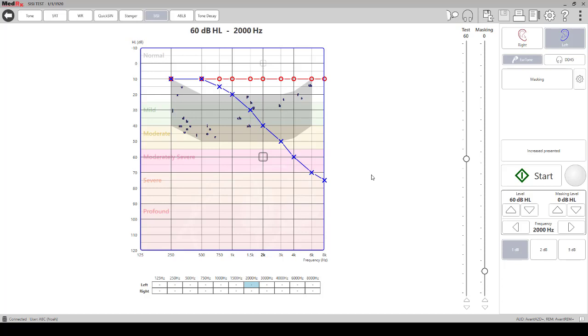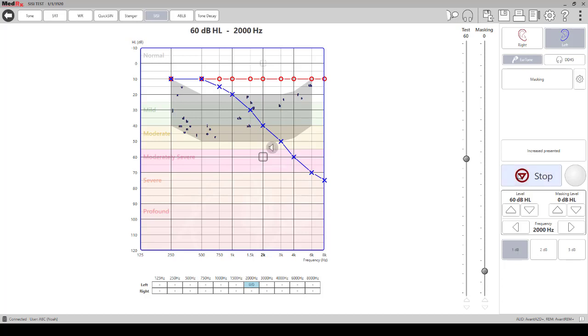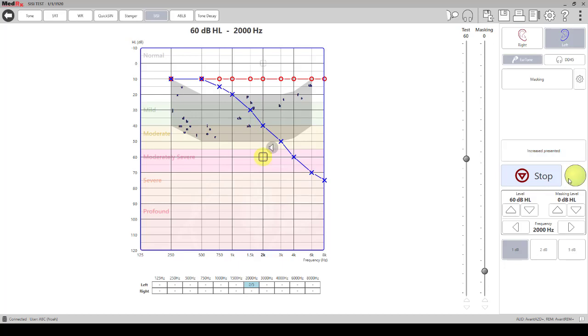You want to instruct your patient to let you know by either clicking the button or you can have them just signal to you when they hear the increase in tones. All we need to do is then click the start button. You'll see that it's going to start to tally how many correct responses the patient has versus how many times the increase was presented. Every time the increase is presented you will see the box light up here, and every time the patient selects the button that they heard the increase you'll see the yellow circle light up.